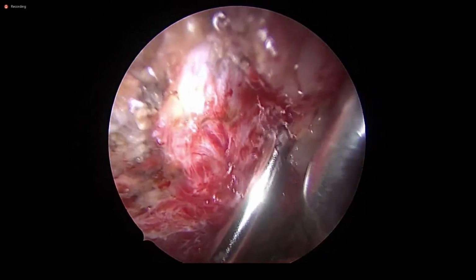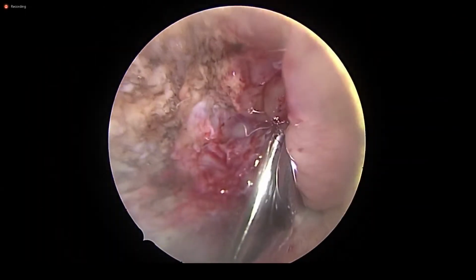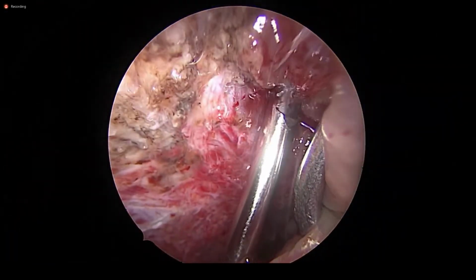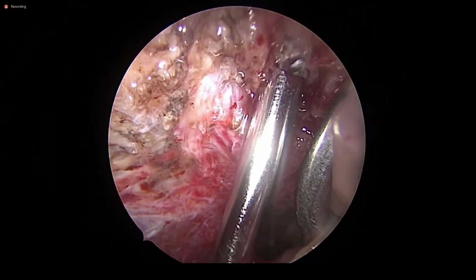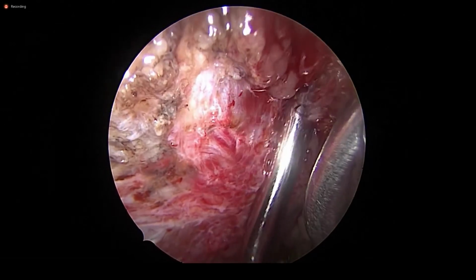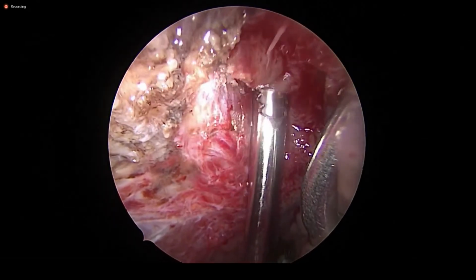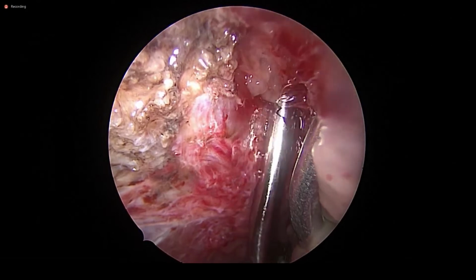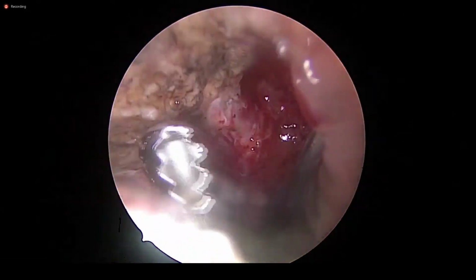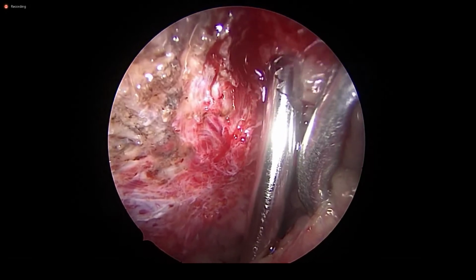See, press on the posterior muscles. See this? Yes, sir. Same blade, same blade, not cutting from behind. Same blade, under vision, not poking anything beyond visualization. Allow the adenoids to fall into the blade. See this. That's the plane. See these laterally hypertrophic adenoids?